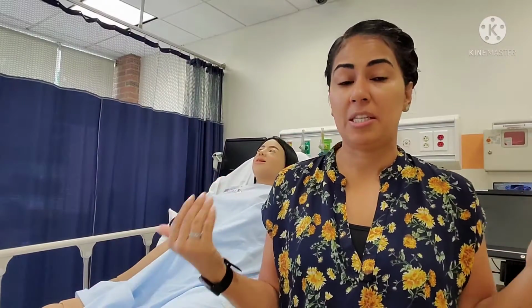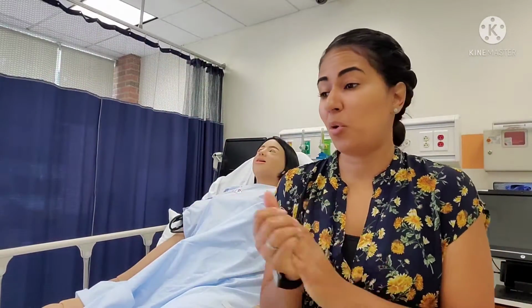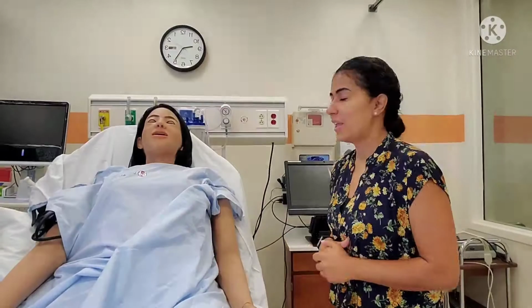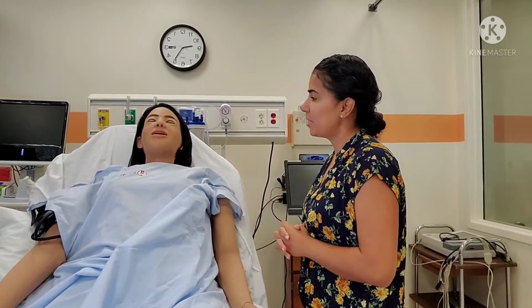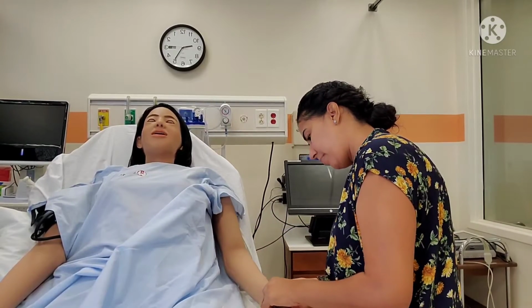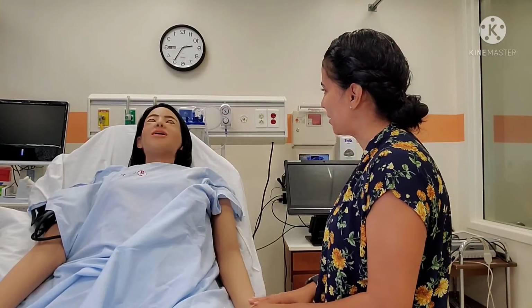So my patient comes back and they have a chest tube. Now we're going to talk about what a nurse should do to take care of this patient. So first thing I'm going to do is go ahead and perform some hand hygiene, and I'm going to knock on the door. Hi, I'm Erica. I'm going to be the nurse taking care of you. Can you tell me your name and date of birth? And I'm looking. Okay, Jamie Hill, January 7th, 1984. Yep, that matches my record.